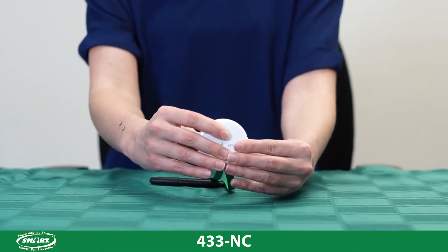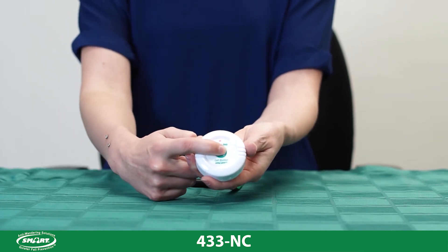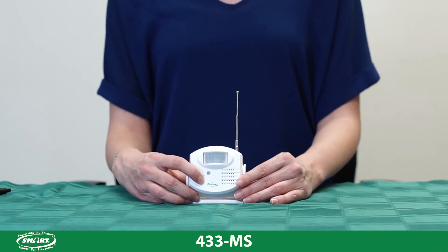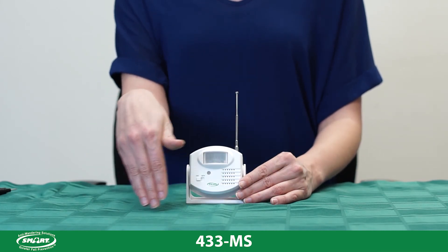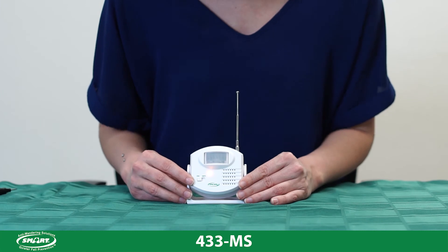Test the unit by pressing the button on the front. You will see a red light when the call button is pressed. To program the 433MS motion sensor, first turn the motion sensor on. Now wave your hand in front of the motion sensor until you see a light blink on the front of the motion sensor. This will send a signal to the receiving monitor. Then you can turn your motion sensor off.